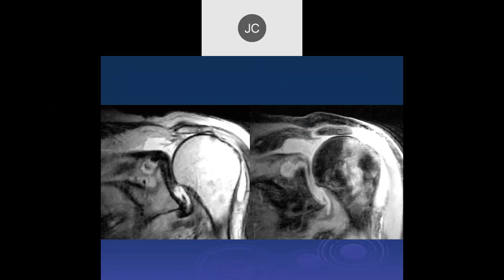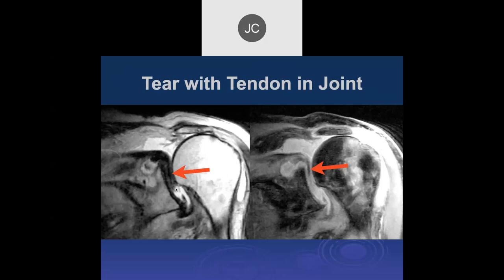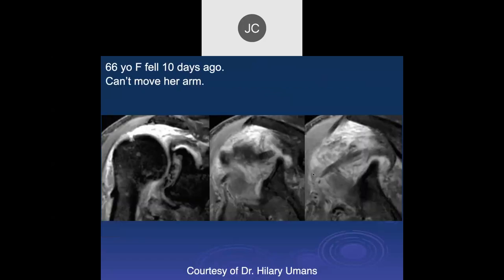Two coronal images show a large subacromial/subdeltoid fluid collection. The supraspinatus looks completely torn, with the torn tendon likely in the joint space. The humeral head is elevated with edema in the humeral head. This is uncommon but should be reported to the referring physician — a situation where the torn tendon has actually extended into the joint space itself.